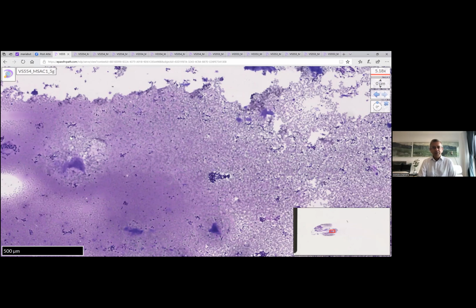Are there any additional comments you can give in a case like this in an exam setting? Frankly, if this is agreed by the examiners as a good example of a colloid nodule, Thy2, then you don't really need to say very much.